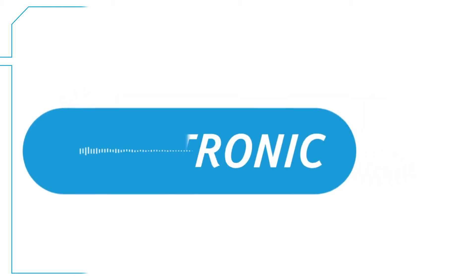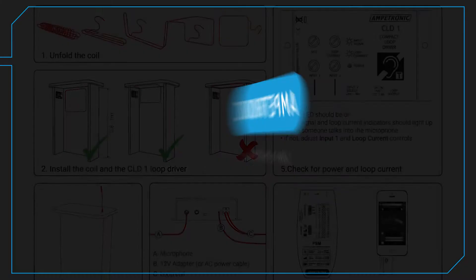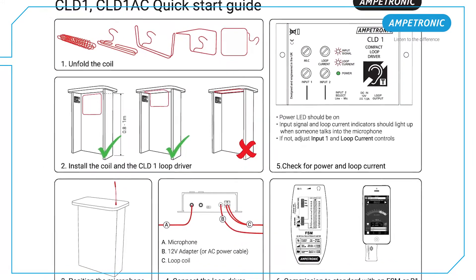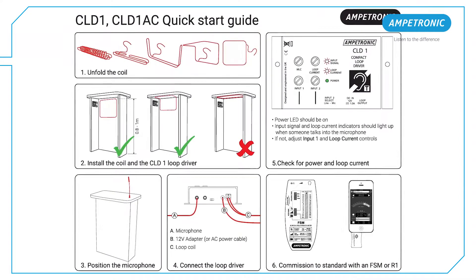Ampetronic. Listen to the difference. Hi there, my name is Ed and I'm a System Design Engineer at Ampetronic. I'm going to talk you through the installation of a CLD1 counter loop system.